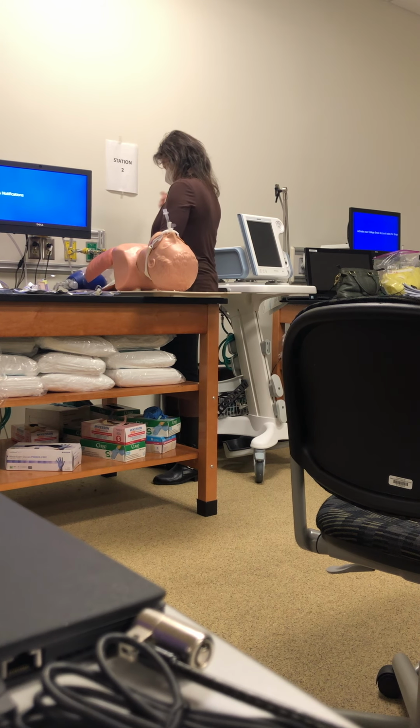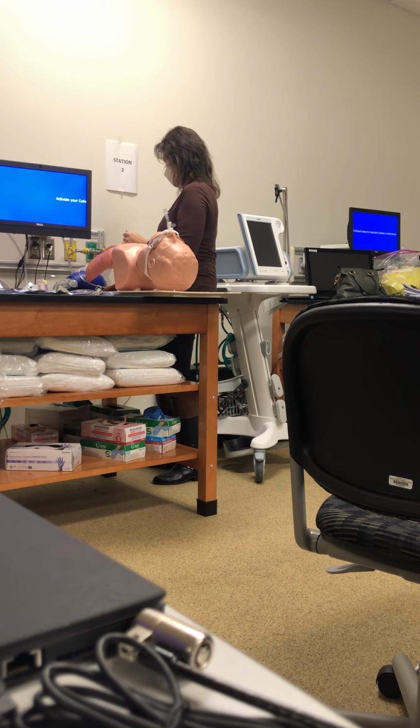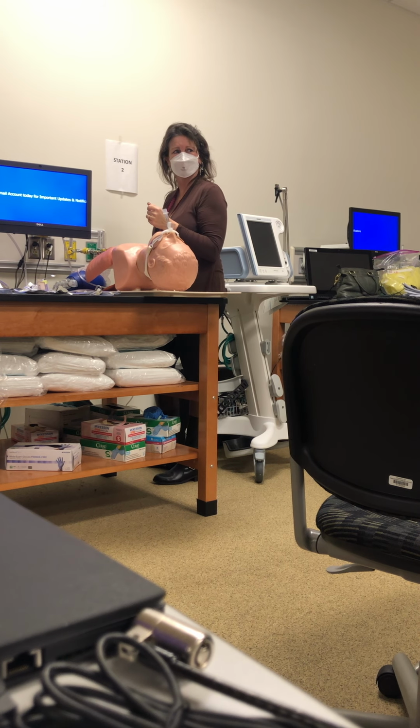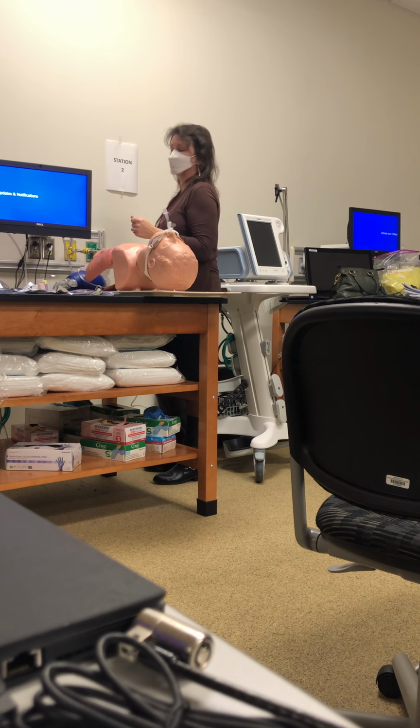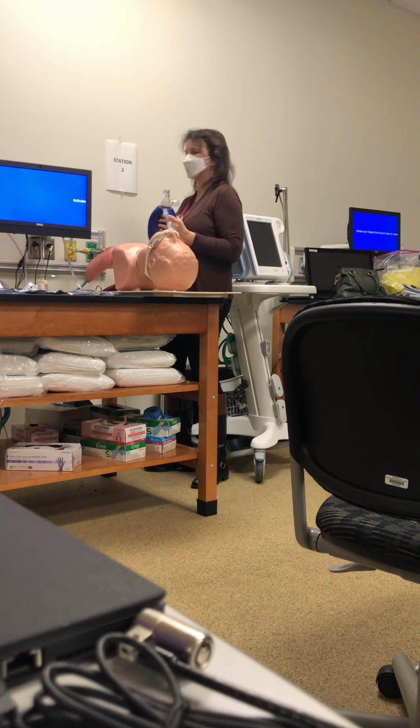How many liters? 10 to 15. For an ambu bag? 12? Yeah, so I think it's 12 to 15. I would never do 10.